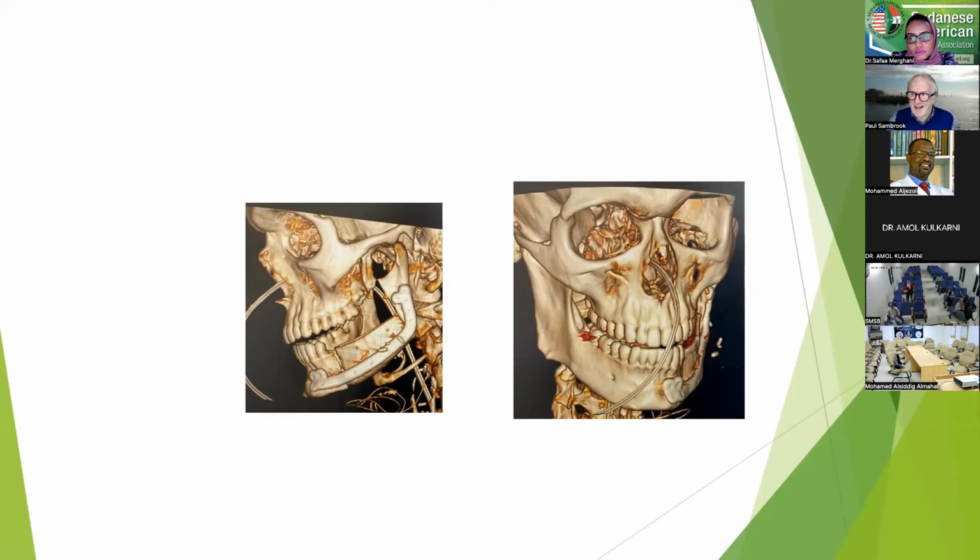They don't want to come back. And so if we can try and do the maximal reconstruction at the same time, then we have started doing that. And there are some of our colleagues that would suggest that a number of these implants may never be restored, and that may be so. But I think the quality of life that we can provide these patients now with some of the reconstructions that we can give far outweighs the odd implant or two that is never used.